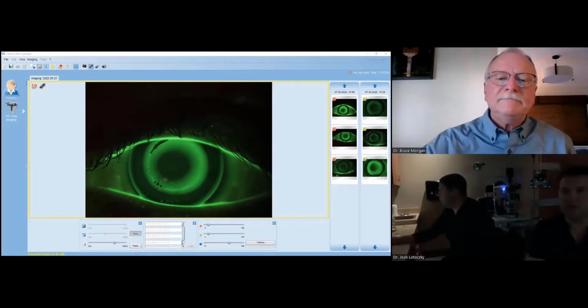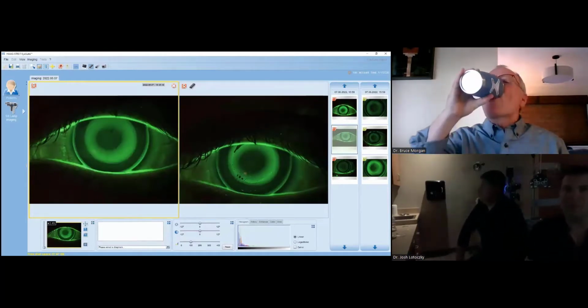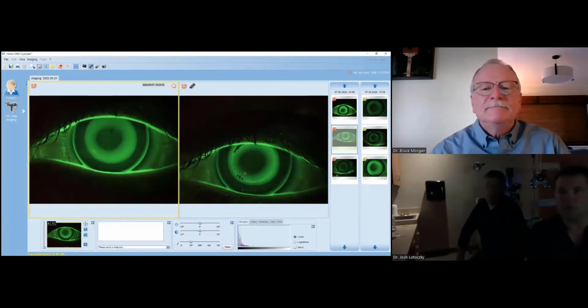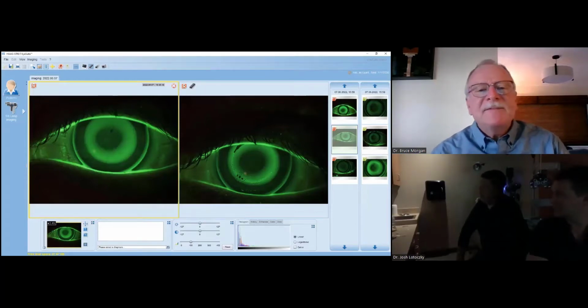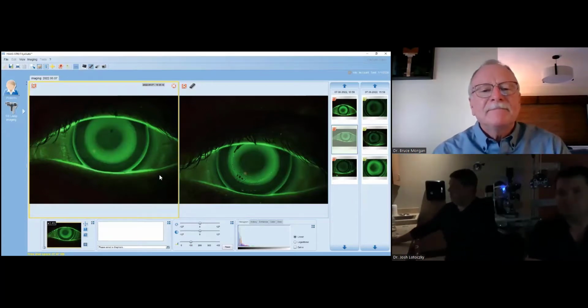Yeah, for sure. A lot of people will get focused on that bubble and say, yeah, it's there, but if it's a smaller bubble, it generally is going to work its way out. But yeah, we can see pictures side by side. Yep. See that central zone? The one on the left was on the eye for a lot longer than the one on the right. I think the one on the right is going to get an even more defined zone the longer we let it go.